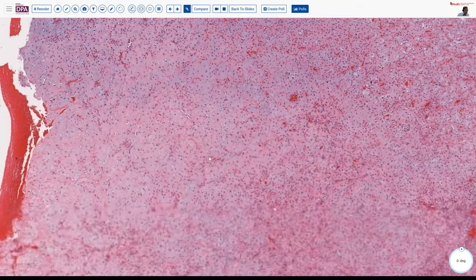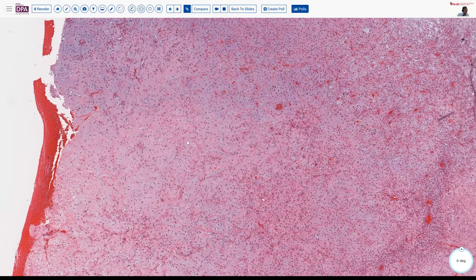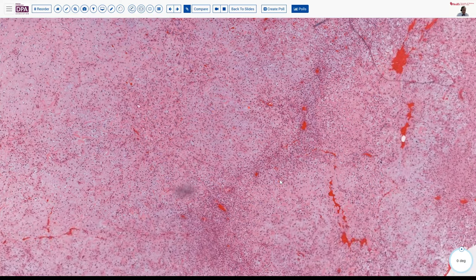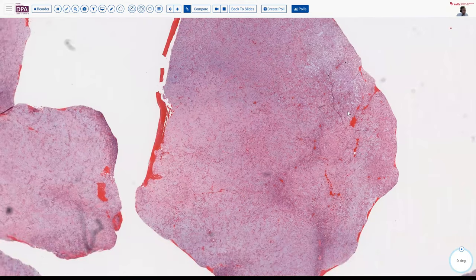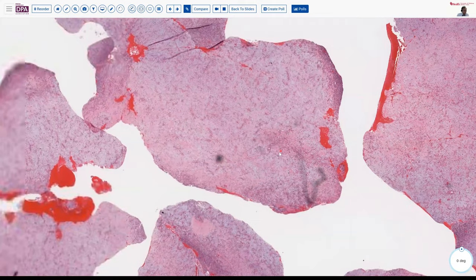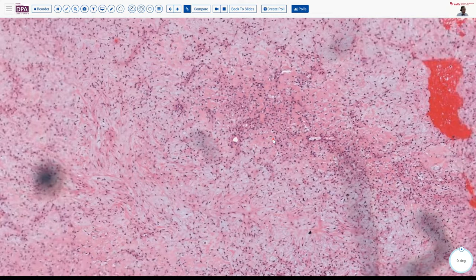So this lesion, you can almost make the diagnosis by just describing it. It's a low cellularity lesion. It's got this myxoid and cartilaginous matrix. If we add then a few areas where it's maybe a little bit more fibrotic, like right here, maybe we would come up with the name on our own of a chondromyxoid fibroma, which is the diagnosis in this case.